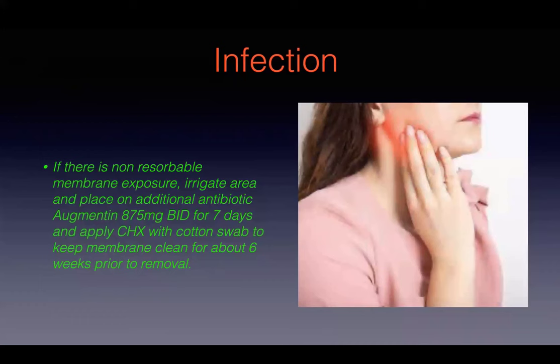Here's a 3 week post-op. And just in the 3 week post-op, you can see all the horizontal gains and the keratinized tissue already filling in. You could see already from the pre-op to the 5 month post-op how much bone we gained there. So now she was ready for implants.